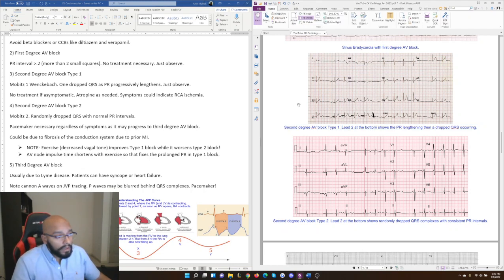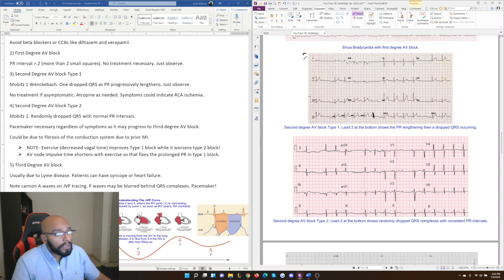So if we look at this ECG, the bottom part is often given as any one of the leads. So when you look at an ECG, most times when we study ECGs, we only see this portion. And this portion can be any one of these leads, but a longer strip, okay? You want to look at the longer strip to identify any fluctuations that are occurring over time in terms of regularity and rhythm, okay? There should be regular distance between QRSs, there should be good rhythm, there shouldn't be any fluctuations like that, right? We do see fluctuations. I highlighted it over here, and then here it's not being highlighted, so you can see it here as well.